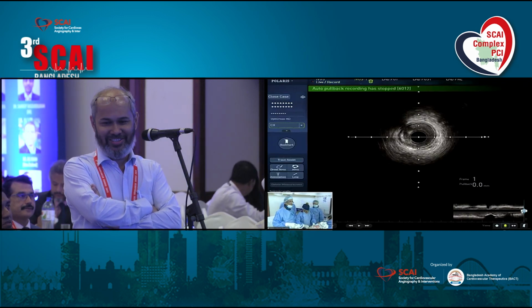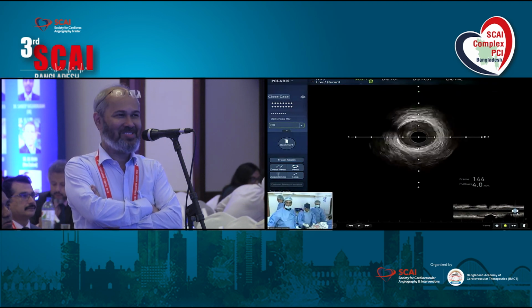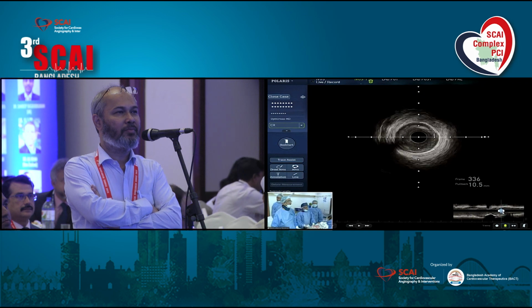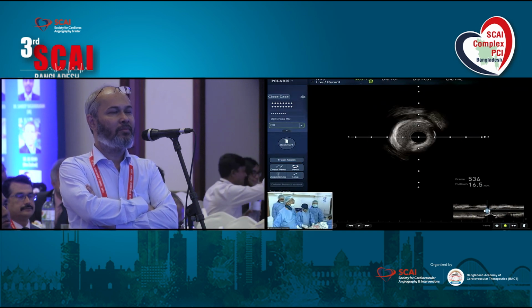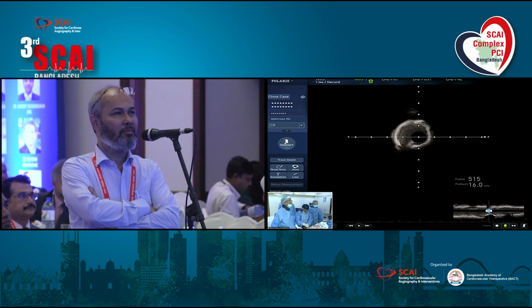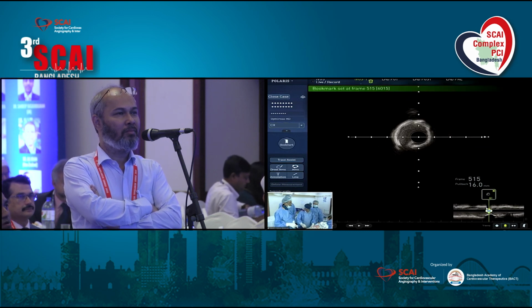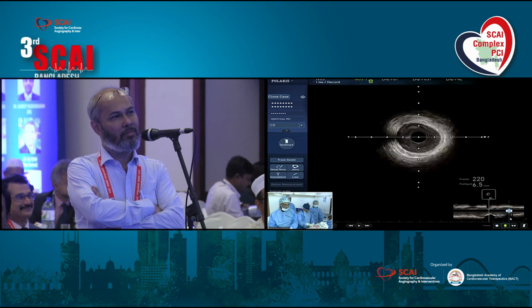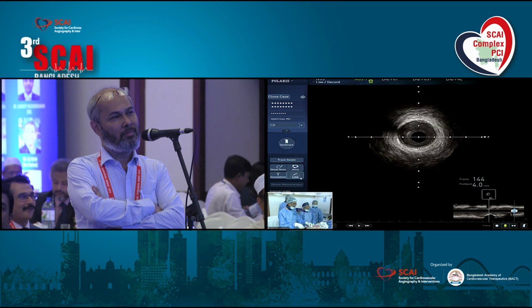Very good size vessel. There is a small dissection here, a small dissection due to the balloon predilatation, and it will be covered. Would you leave that alone now, Dr. Azam? You're saying that we can leave DCB. No, not DCB. I think they were saying that we can leave that alone. Never.